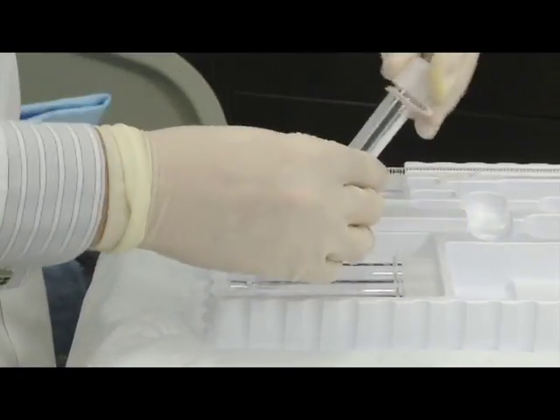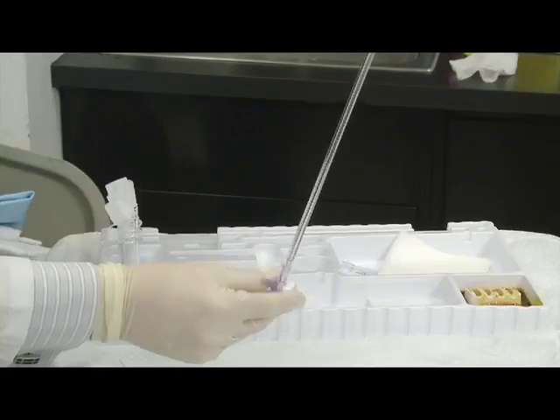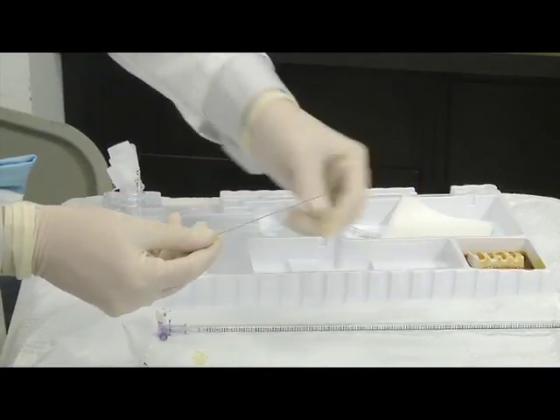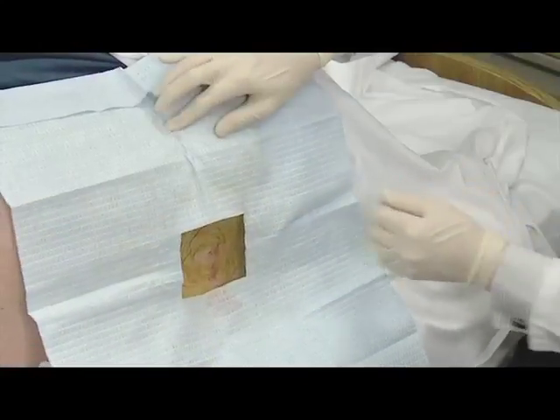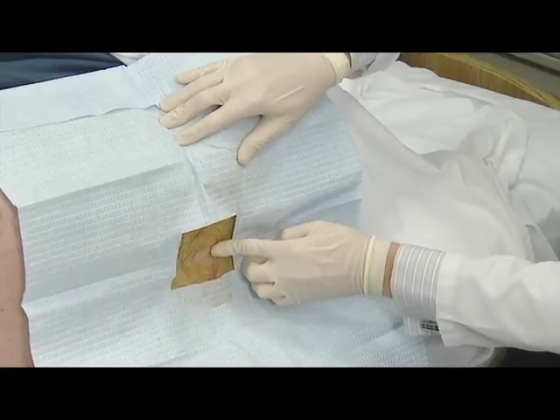While the lidocaine is taking effect, organize your equipment, open up the collection tubes, assemble the manometer, and check the spinal needle and stylet. Repalpate the landmarks as the patient may have moved slightly during the anesthesia injection.